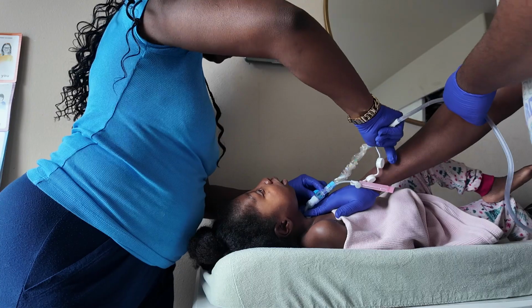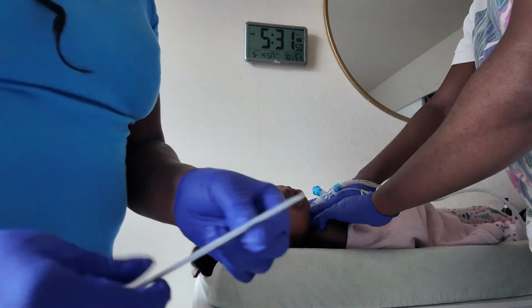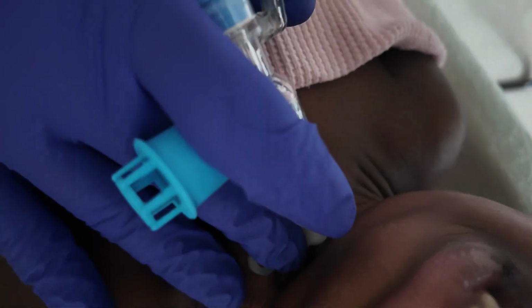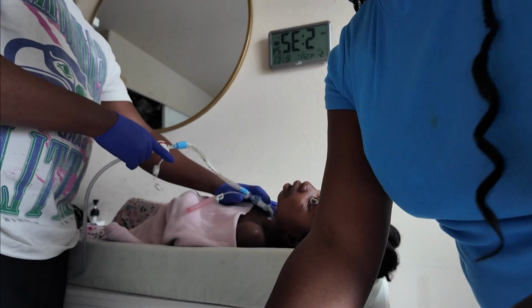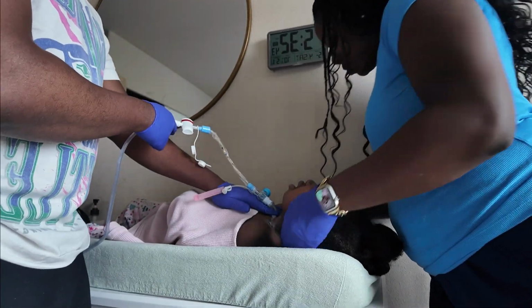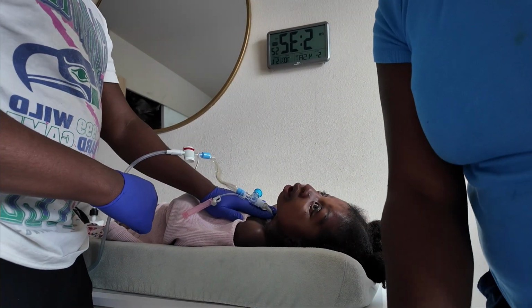Sometimes she needs frequent suctioning and sometimes she doesn't need that many at all. So it just depends on the day she's having, but I'm recentering her neck a couple different times. So she's looking straight up. As you can see, a little bit closer angle of what it looks like when the ties are off in her neck. So it's so key for that holding position that I can get in there and that the fingers are placed. Sometimes, as you see, he is moving his hands back and forth, sometimes using 2 fingers to hold each side, and sometimes he uses 1 finger and lifts the other one up so I can clean it.